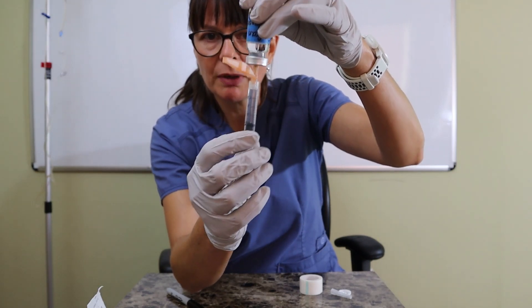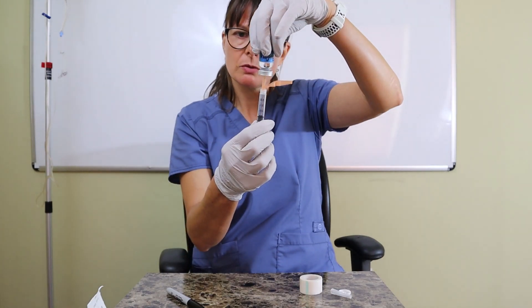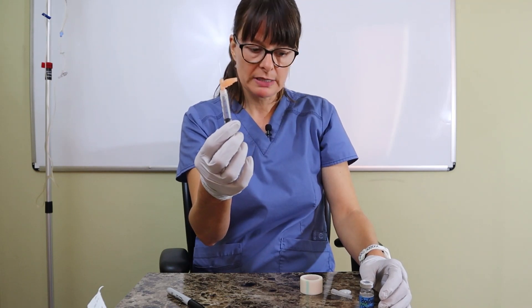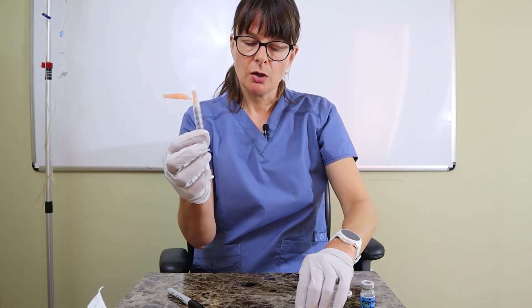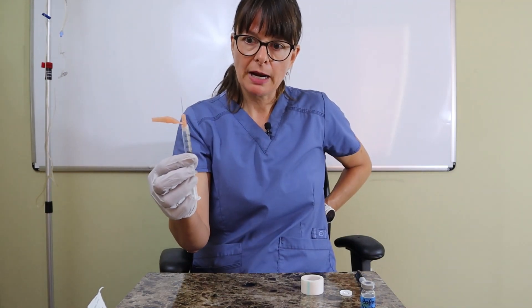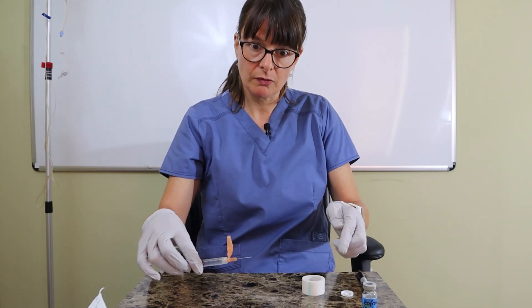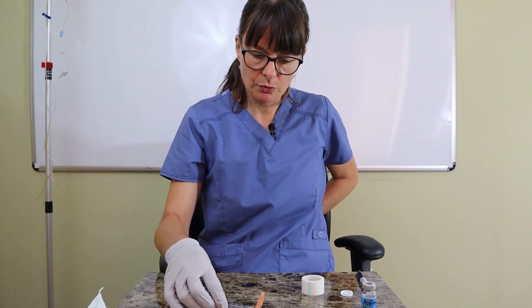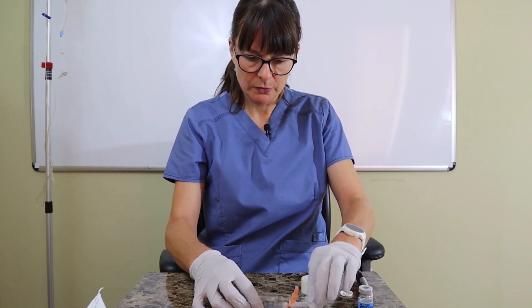There are a couple of tiny air bubbles — those don't really matter. The large one I had at the beginning was the important one. As soon as I pull this out, I need to be careful not to contaminate myself or poke myself with the needle. When recapping, put your non-dominant hand behind you so you're not inadvertently pushing the cap and hurting yourself. Then use an object like the vial to push the cap back on.